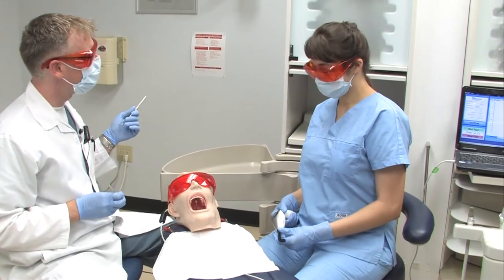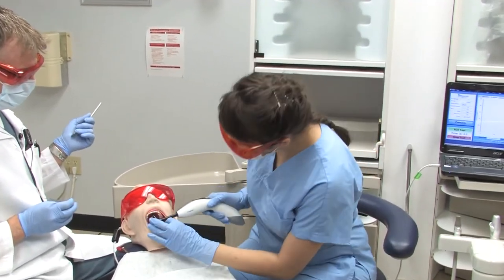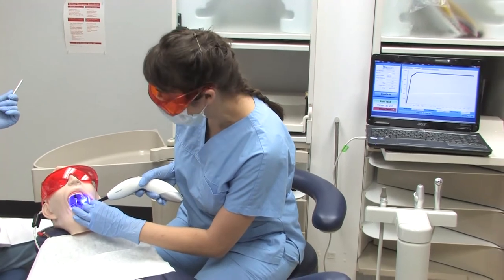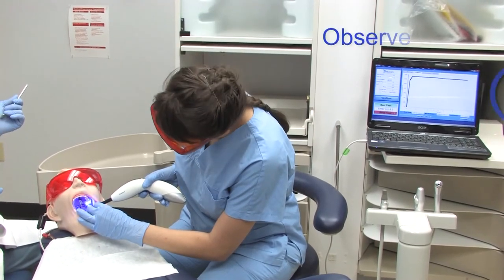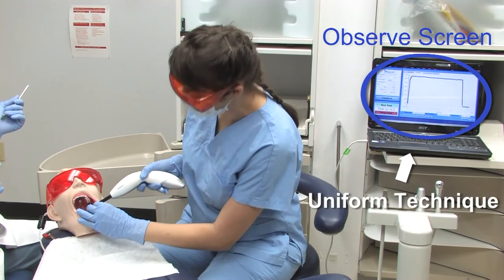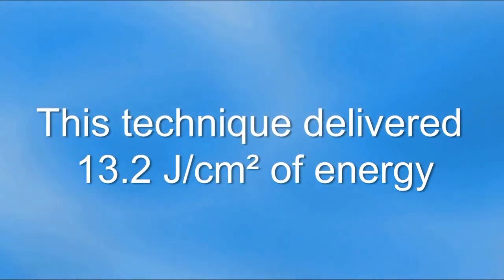Sonia is again asked to cure tooth number 27, and is again interrupted mid-procedure. However, when the operator stabilized the light at 90 degrees to the preparation and used blue blockers so she could watch what she was doing, she delivered 13.2 joules per centimeter squared — even when distracted. As a result, more than double the energy was delivered to the resin restoration.